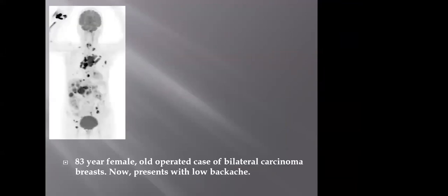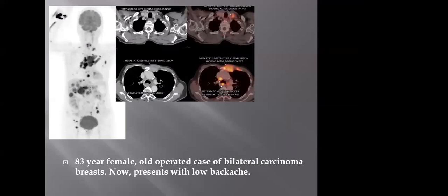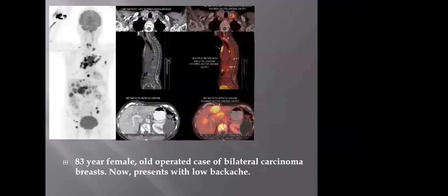Coming to recurrence case discussions. This is a case of an 83-year-old female operated for bilateral carcinoma breast, and now presented with just a low backache. On the PET scan, you can see the MIP image. Also, there are multiple hot spots. On the cross section, there were nodal masses infiltrating the sternum. Next slide. There were mediastinal nodes, there were liver deposits, there were bone metastases. Next slide.